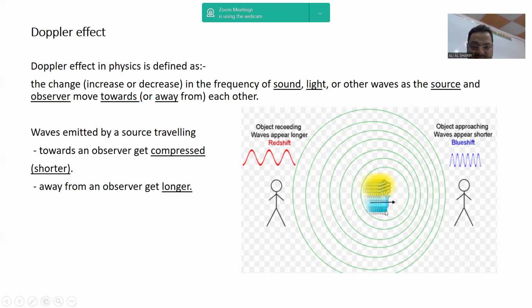By increasing the distance, the sound power will decrease. Here the situation is different. Why? Because the distance between the source and the observer is decreasing. By that, the sound power will increase. Like I said before, it's a reverse relation.